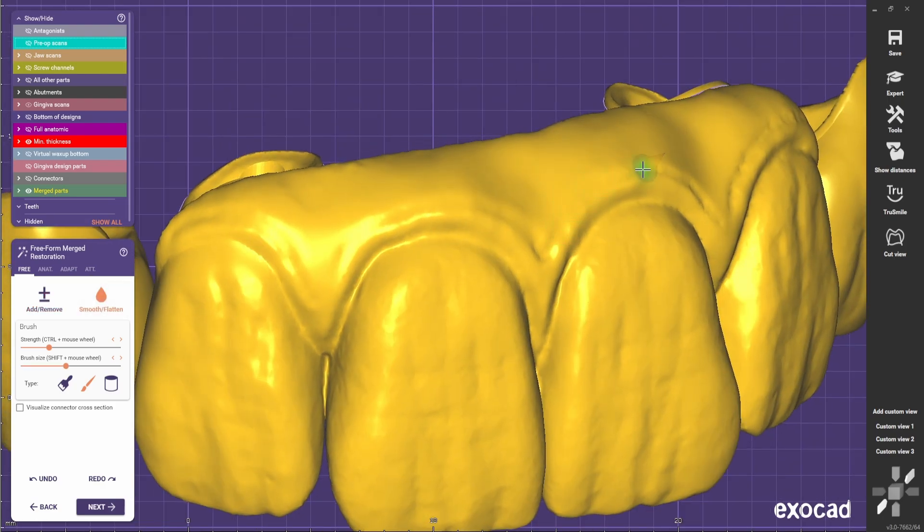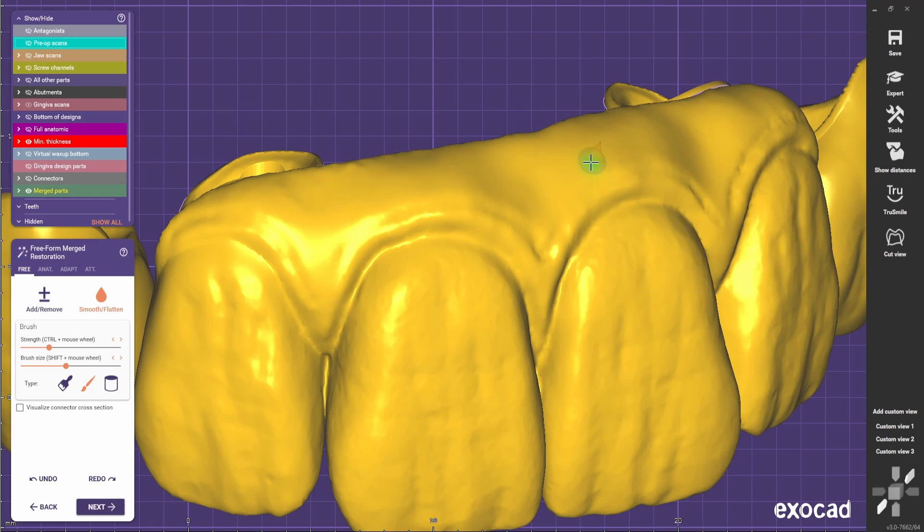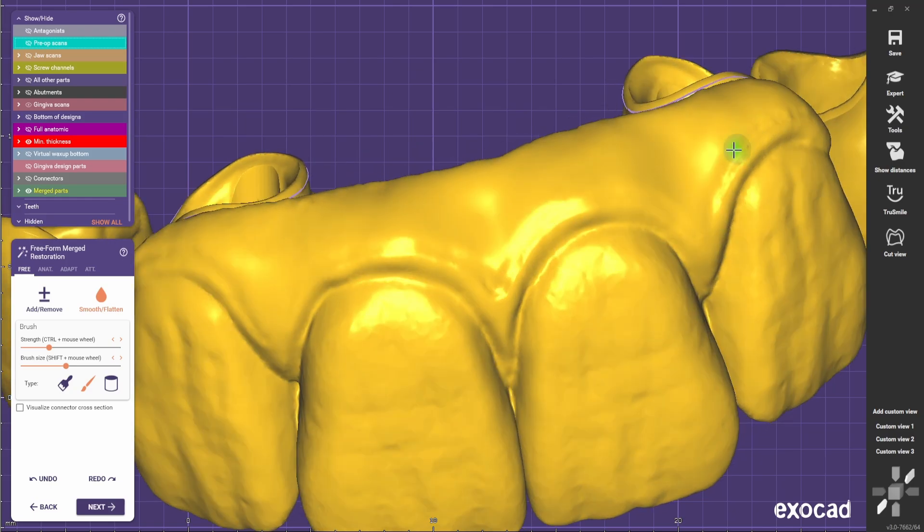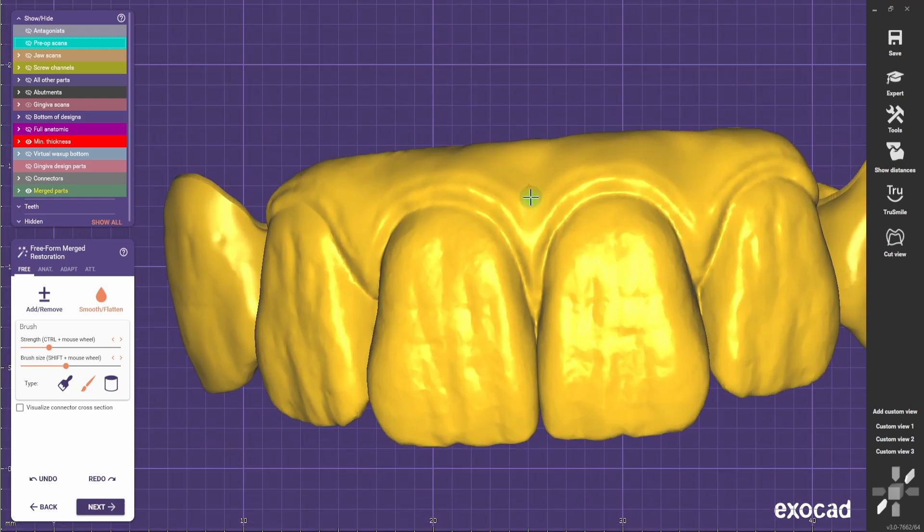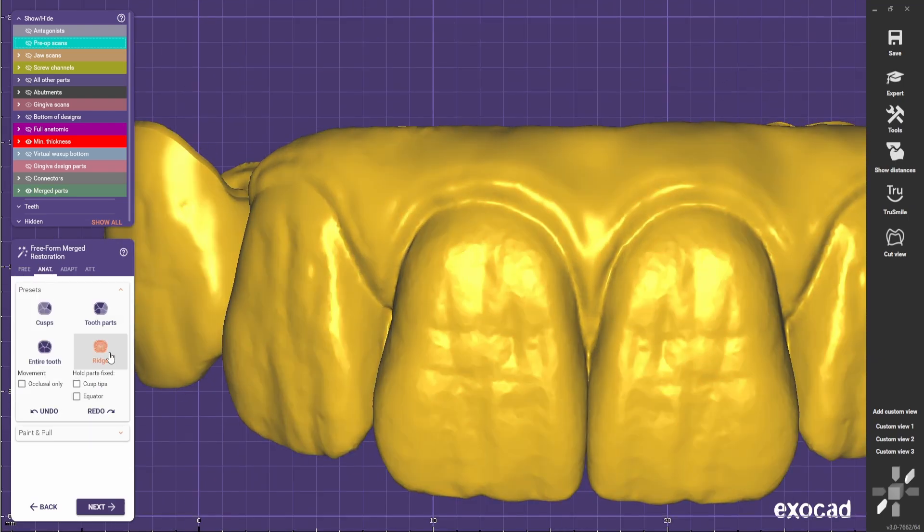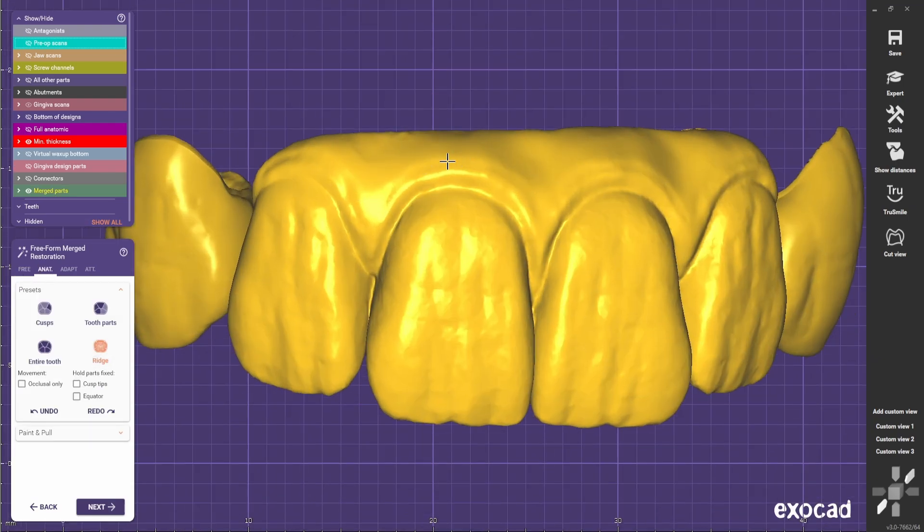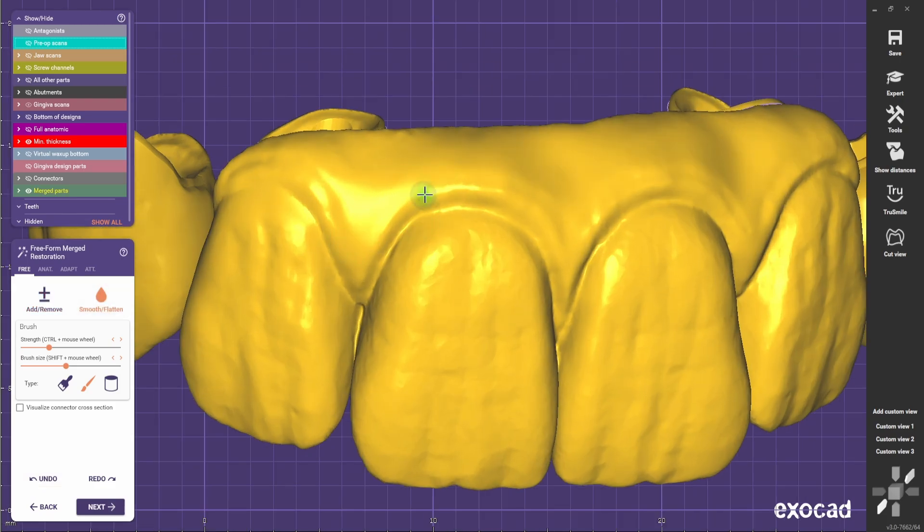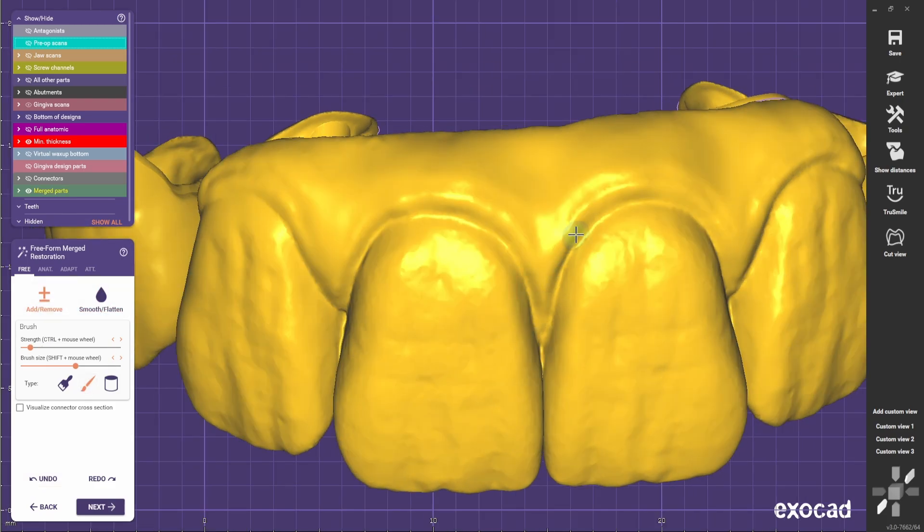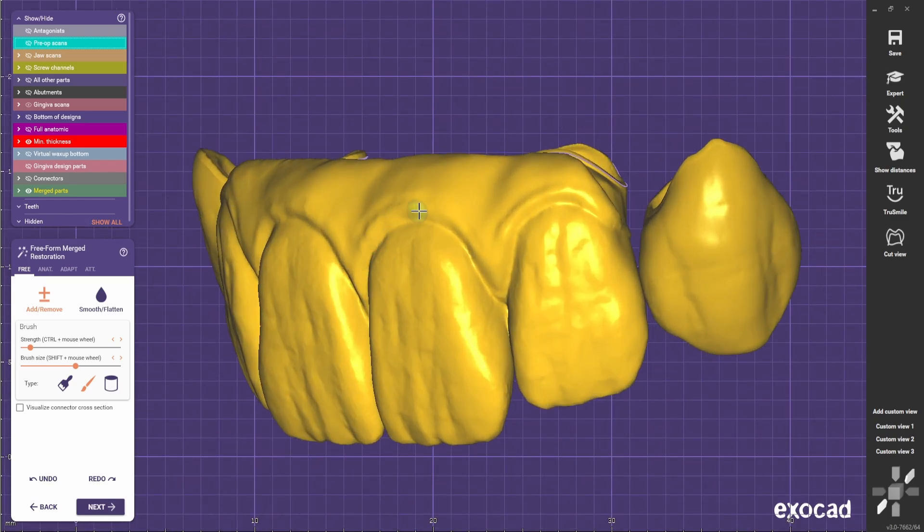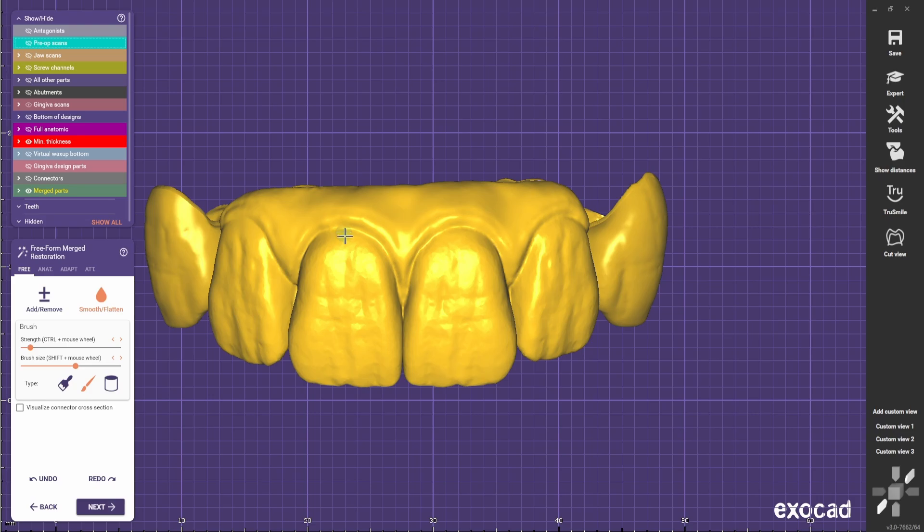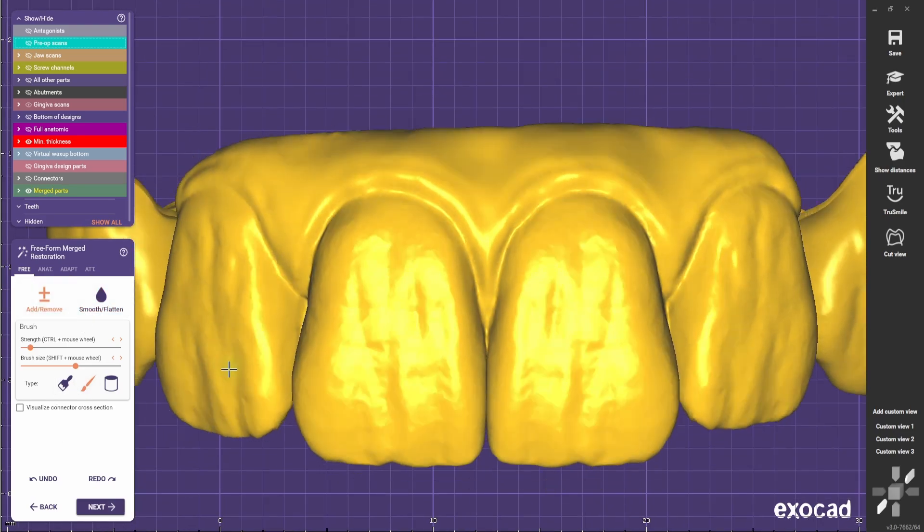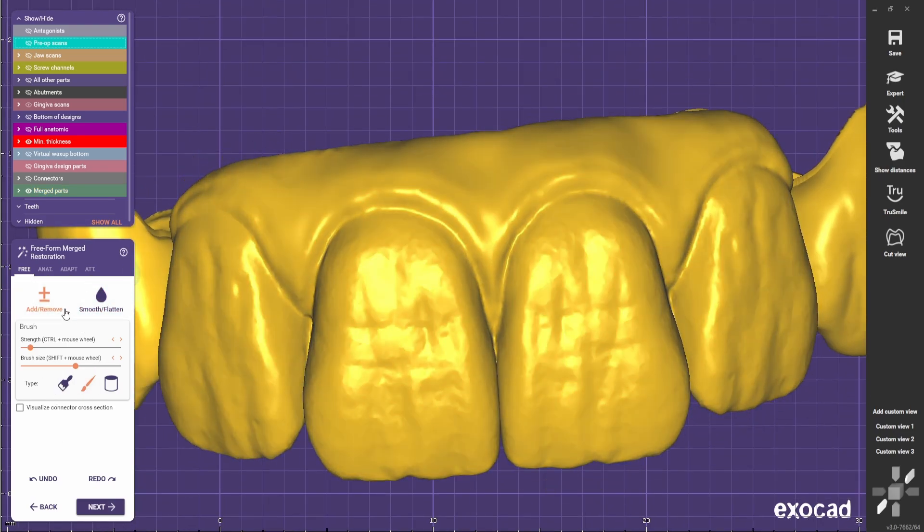Always smooth a bit because none of this is very noticeable. It shouldn't be a harsh transition or a very deep groove. Now we're going to do some depressions in between the teeth.